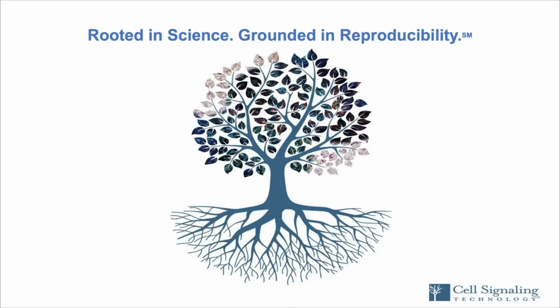Yeah, so I will say that we always recommend that you make your dilutions fresh if possible. We've done a couple different stability studies with a few CST antibodies and found that if you dilute them and store them at 4 degrees C, they can be stable for an extended period of time, but I do not believe that every CST antibody is going to be stable for an extended period of time.